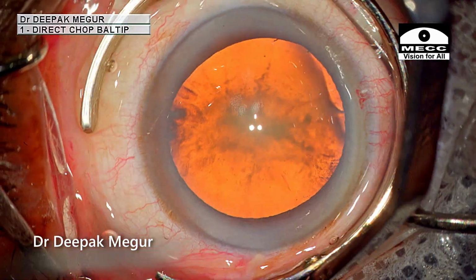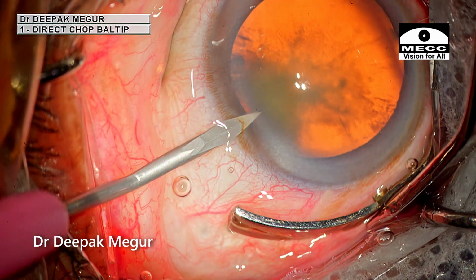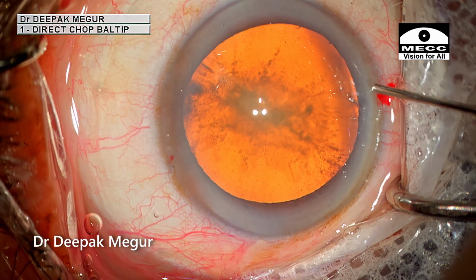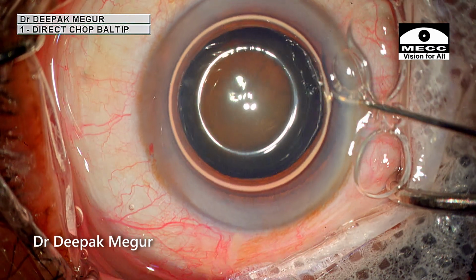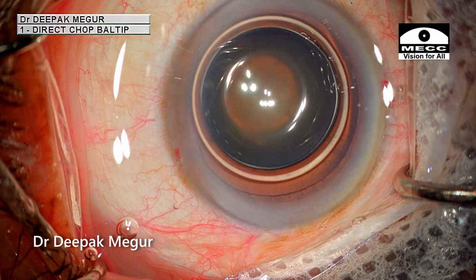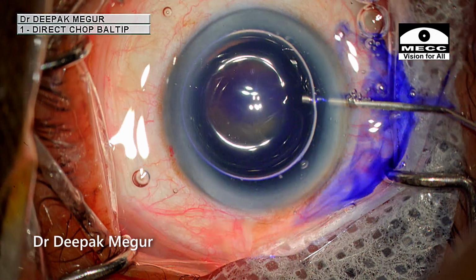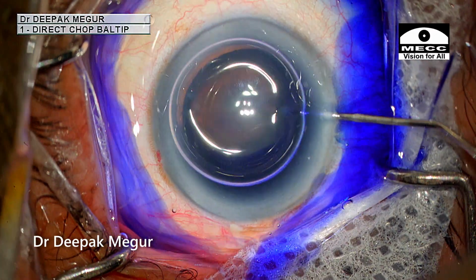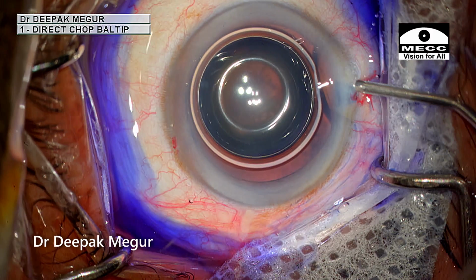Again, I always ensure that it is the posterior limbus because the tissue is quite thick here, and I also ensure that I have a nice tunnel there. I'm using intracameral anesthetic, 1% preservative-free lignocaine, under the air bubble, under which I'm again injecting some dye, which is then washed off. So this is usually my strategy. Even in cases of immature cataracts, I find myself often using trypan blue.